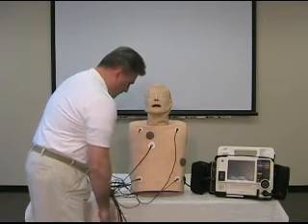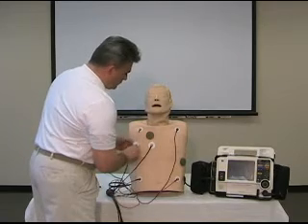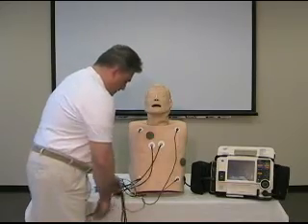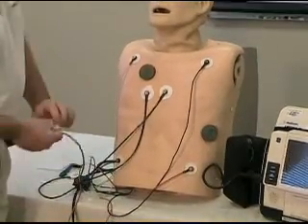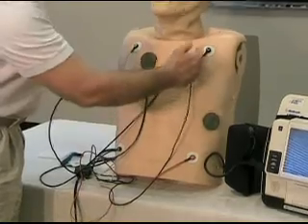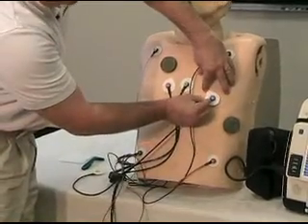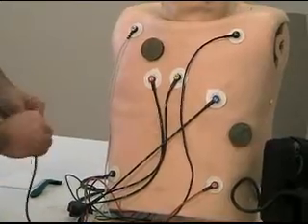Next will be V2. V2 goes fourth intercostal space just to the left of the sternal border. Next, apply V4. V4 will go fifth intercostal space mid-clavicular. Next, apply V3.